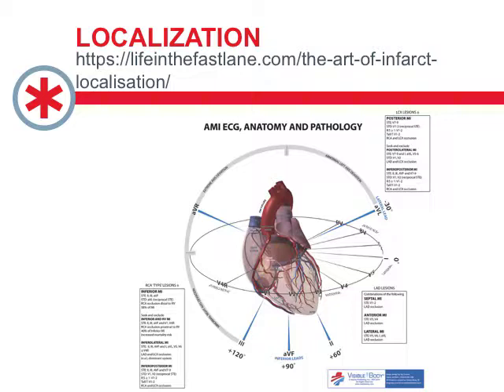Similarly, if you remember leads 2 and 3, the positive aspect is at the groin, because the groin is always positive. Well, that's the inferior aspect of the heart. And so those are a couple of the leads that are going to look inferiorly. Same with AVF, which of course is basically pointed straight down if you've been through our leads lecture. So if you know your leads, it's actually kind of easy to remember where things are. Having said that, most people just sort of memorize them.